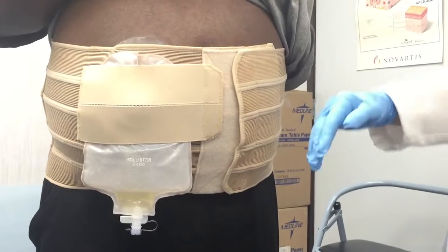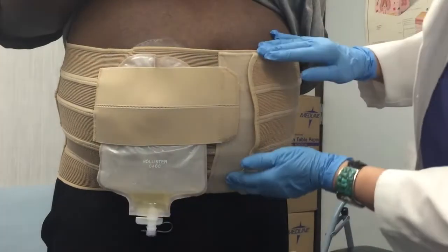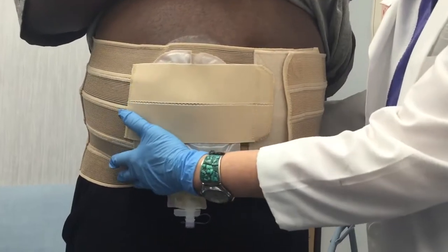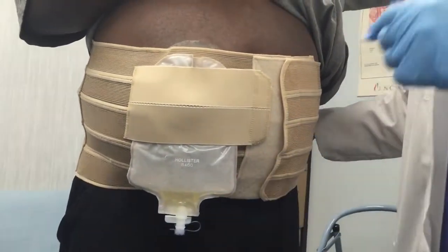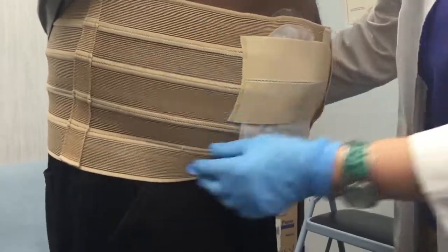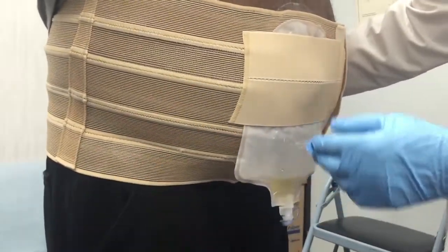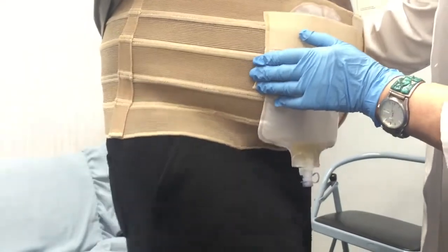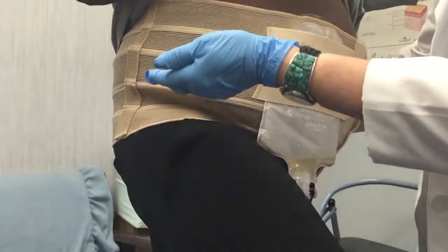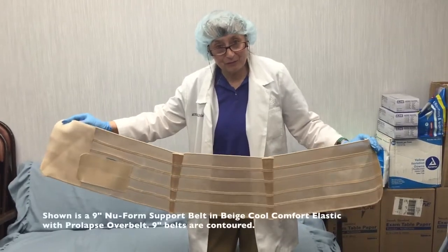Now he's standing up and you can see that the belt is giving him a nice wide support in the front. We don't even see this little hernia here, and this pretty much has reduced this large hernia on this side. However, we've got the nice width in front, but we're going to have a little issue when he sits. If he bends his leg up to demonstrate sitting, you can see it's going to curl and roll and may dislodge the belt. This is the nine-inch belt I've sized for him.